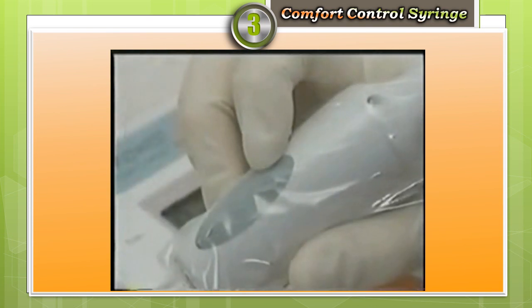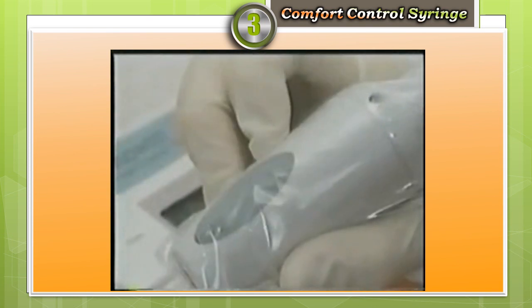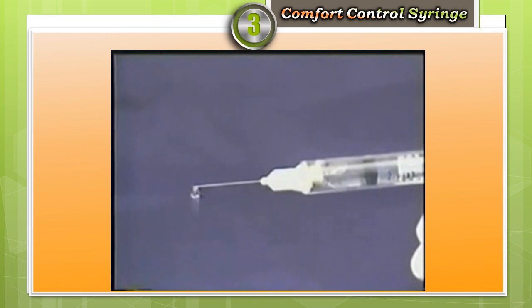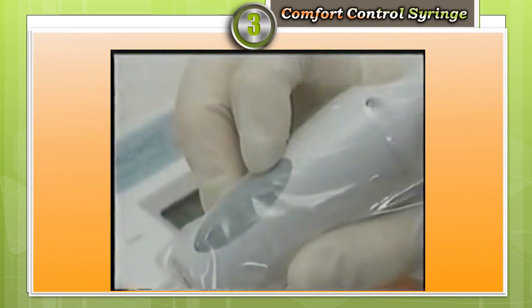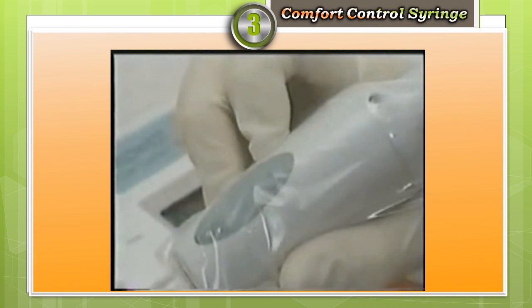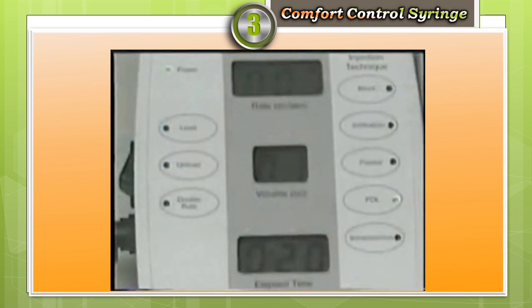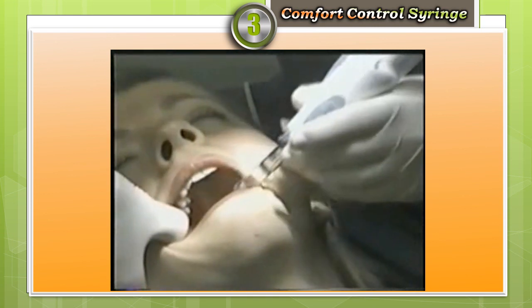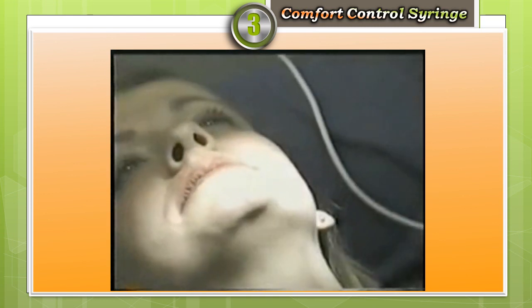If you want to increase the rate of the injection, you can do so at any time after the first 10 seconds of the injection. By pressing the double rate button, the increased rate will be identified by 2 audible beeps. Press the double rate button again to revert to the normal rate. At any time during the injection, you can reference the rate, volume, and elapsed time for that injection. Press stop when you've completed the injection and remove the needle from the patient.